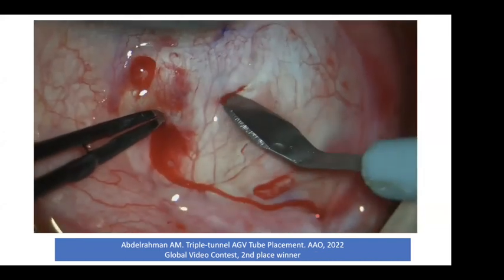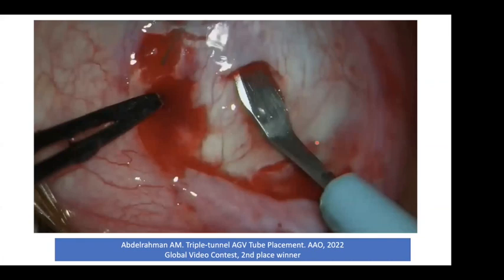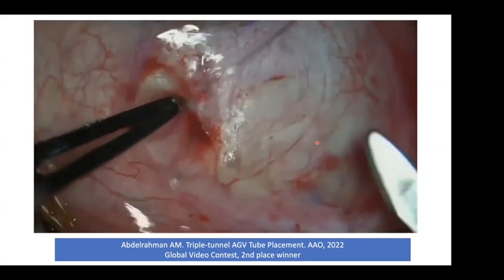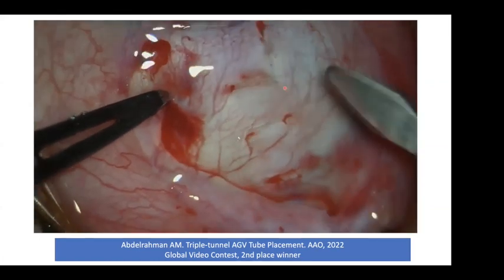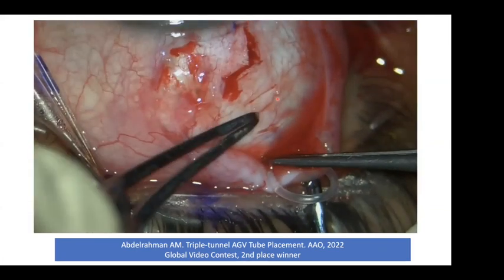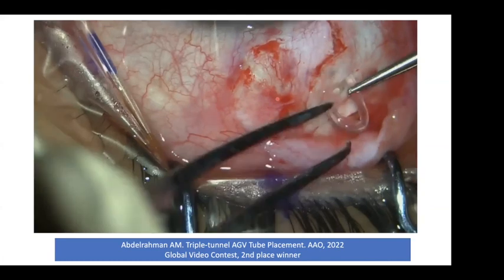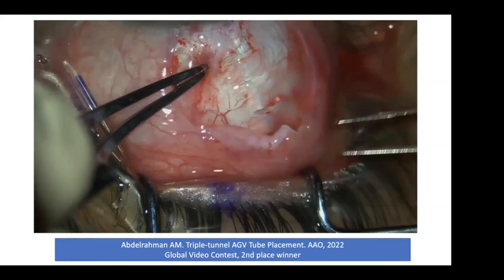this year. So again, this is the last part. Again, it's a flap. I know that you can do a tunnel, but with a tunnel in my hands, it was not easy to implant the tube through the tunnel, so I decided to make it like a trap door, so that you can cut one edge, or you can make it like a flap. So again, you can just gently push the tube, it will come because the tube is beveled, and then you will immediately move it. And sometimes you can do it in a single pass, okay.